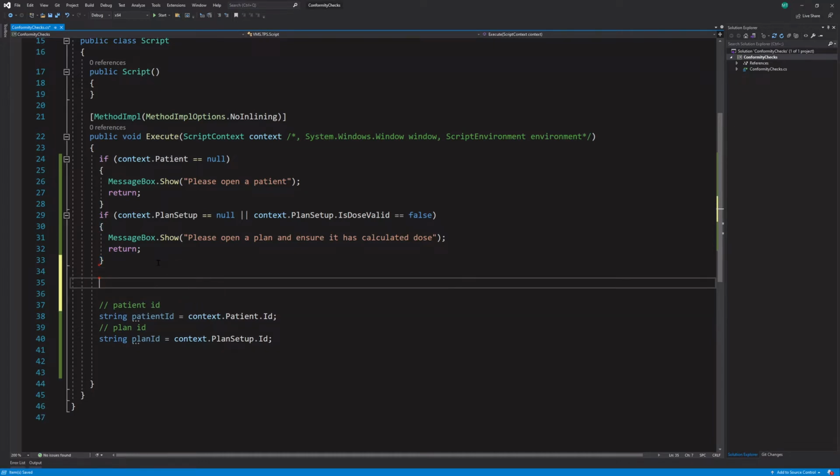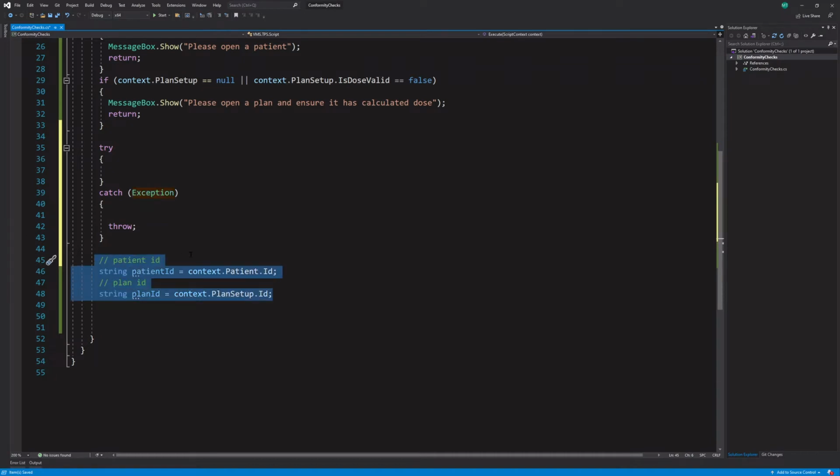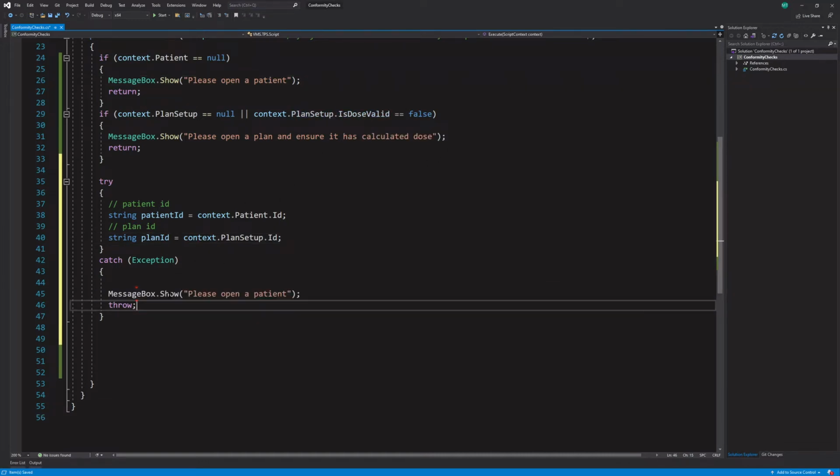And there's another thing that we can do too. If you're new to programming, a lot of the things that I'm talking about, you're probably like, what? But just bear with me. We're just trying to make this a very quick project. So if both of those tests pass, then let's put everything in a try catch statement. What this will do is handle anything else. And we will add another message. I copied that, and I'll say something like, "Sorry, something went wrong."